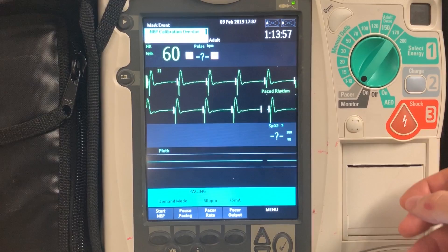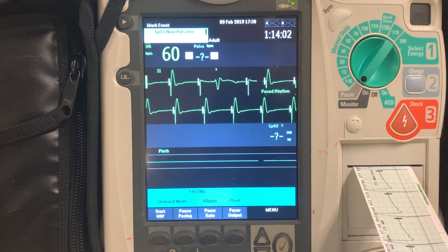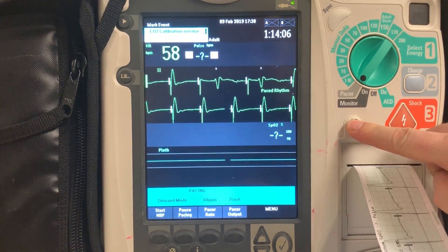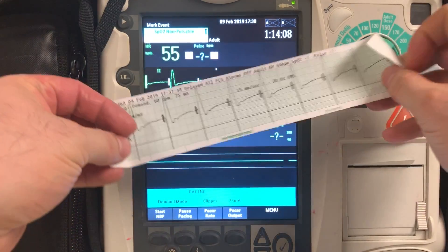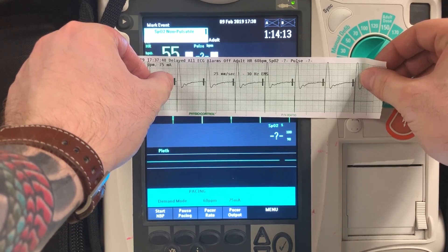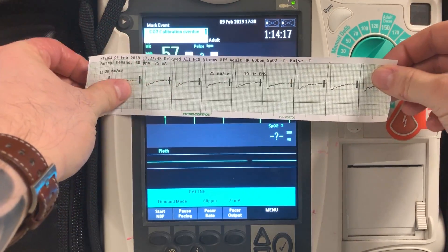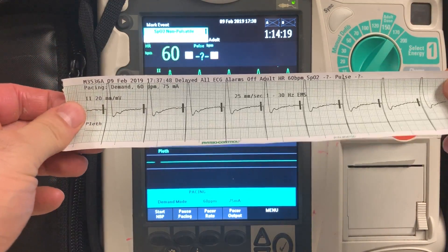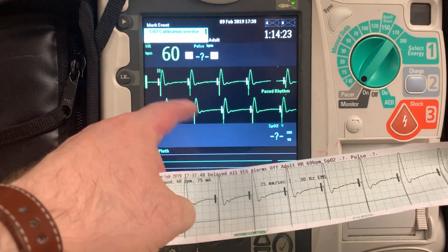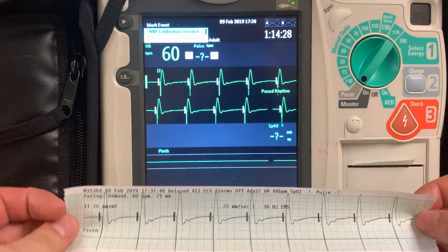I can also print a rhythm strip, and it will show me a static representation of electrical capture. Here you see a strip, and you notice that you have a pacer spike followed by a QRS complex with a tall, broad T-wave. This tells me that the ventricles have both depolarized and repolarized — meaning the ventricles are, in fact, contracting. This confirms electrical capture on the ECG monitor.